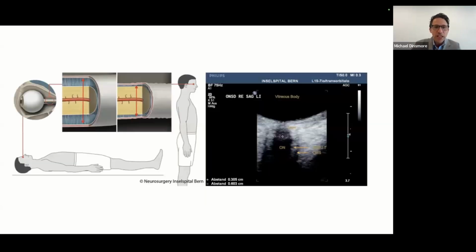Okay, so what they did, they measured the optic nerve sheath diameter when the patient was supine and again when they were standing. Now, what they hypothesized is that often these patients have a CSF leak. And so when they were lying down, the optic nerve sheath was increased. But when they stood up, because of the leak, it actually shrunk their optic nerve sheath diameter, and they could see this. Okay, you can see that the data on the right is good data. Here they can see everything, the optic nerve, the subarachnoid material, and then the dura underneath. So it's a fairly reliable study.